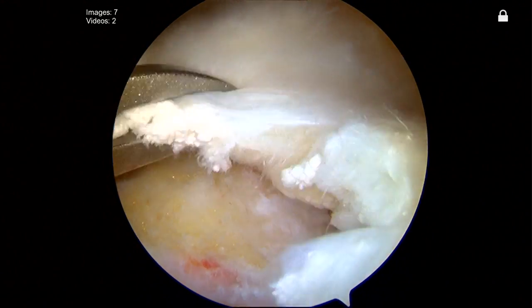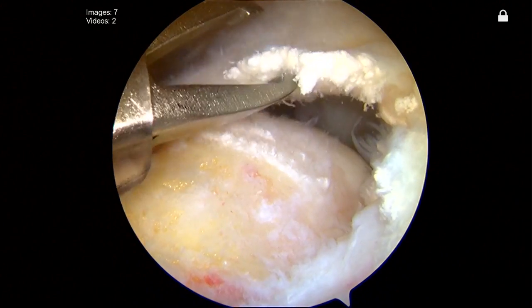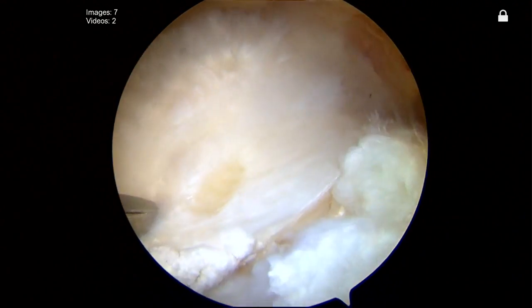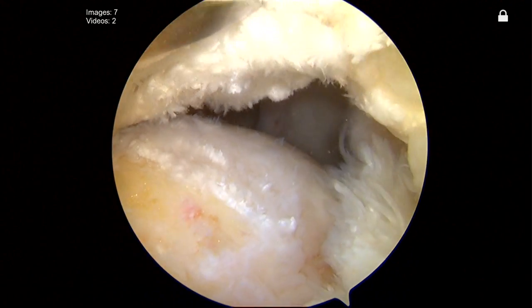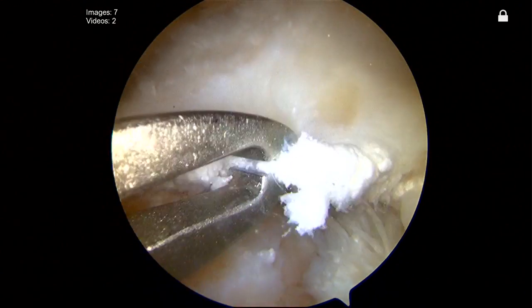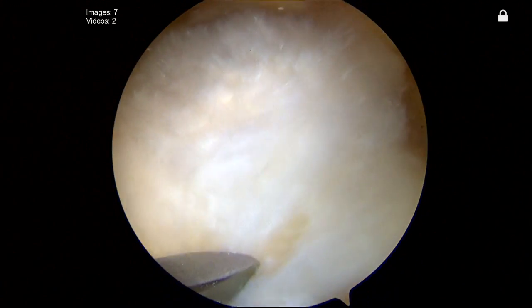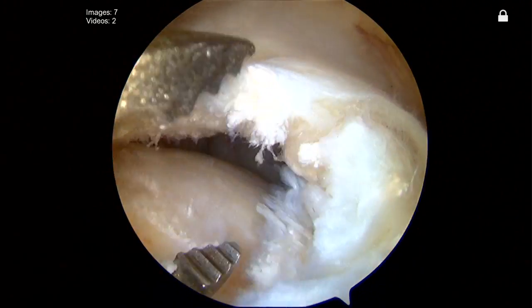We're going to need to pull this tear not just straight laterally, but pull the supraspinatus in a lateral and slight posterior direction in order to achieve the anatomic reduction. You can see the inferior quality of the tissue here — it looks relatively degenerative with poor vascularity. This is really where we're hoping that in the next few years we'll begin to see some biologics evolve that will help us to deal with this devascularization issue.